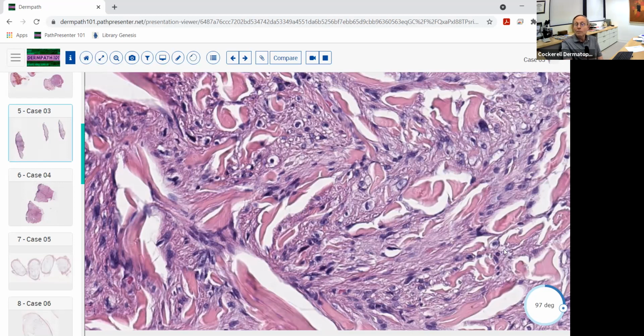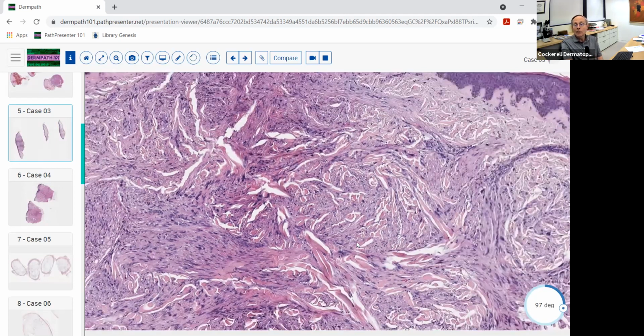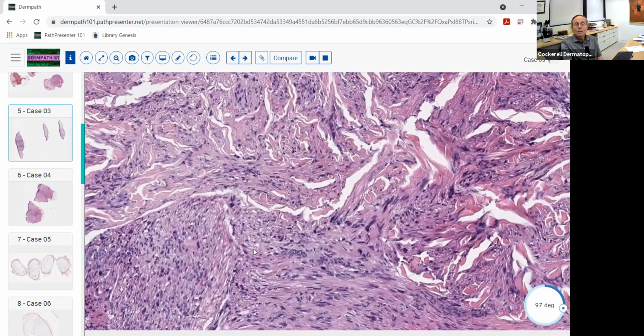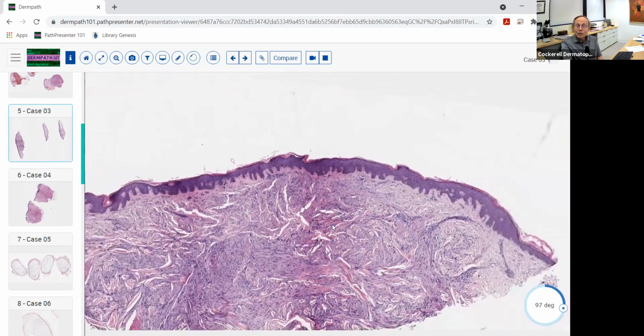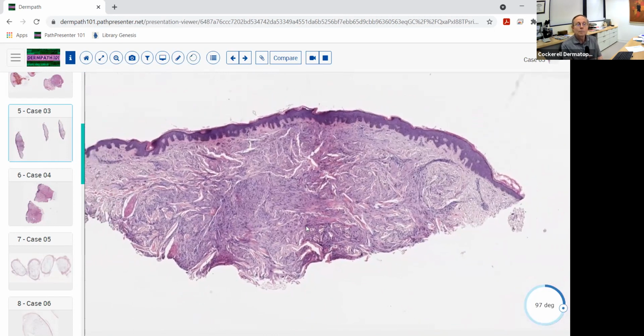But this would be an example of what we would probably call an atypical leiomyoma in a case like this, and we would recommend this lesion be completely excised. So relatively small lesion, seemingly, probably not as aggressive as a fully developed leiomyosarcoma, even though they tend to be relatively benign in the skin. But still, we would recommend excision of this nonetheless. And maybe when you excise it, there's nothing left. And then you wouldn't necessarily need to upgrade the diagnosis to leiomyosarcoma.